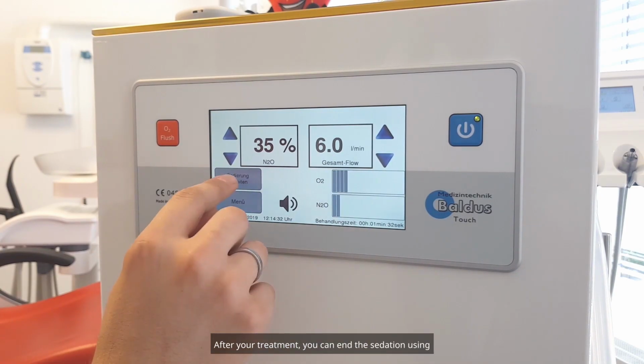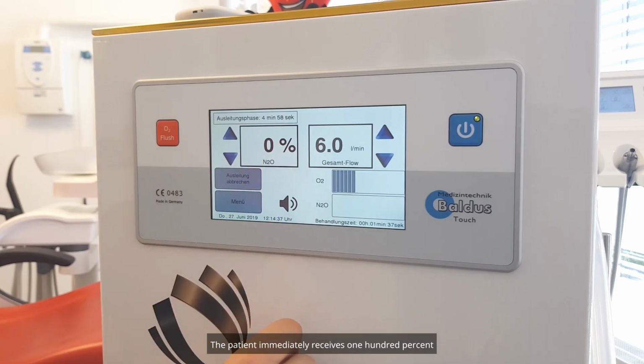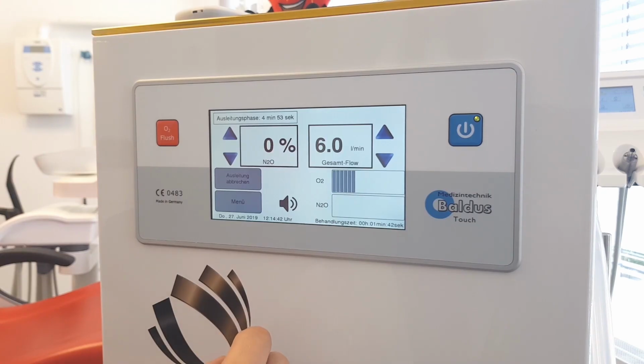After your treatment, you can end the sedation using the end sedation function. The patient immediately receives 100% oxygen at the total flow rate you have set. This elimination phase lasts 5 minutes.